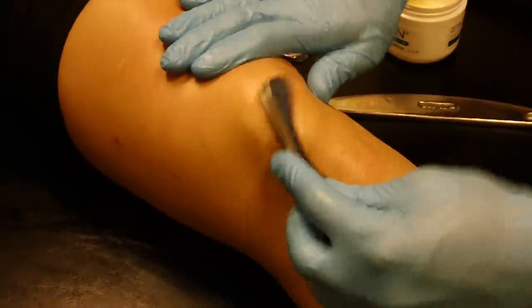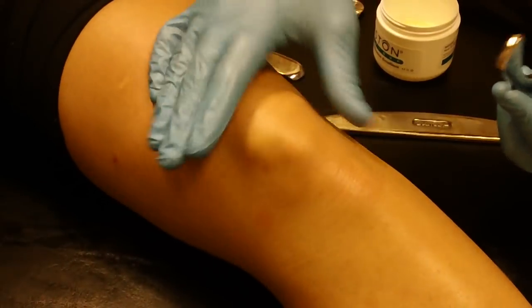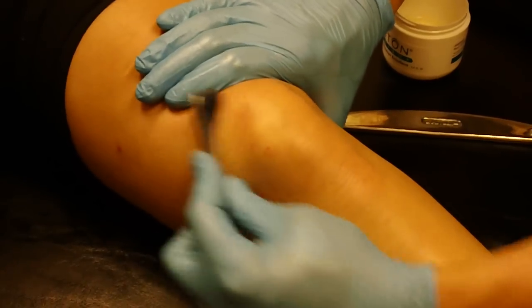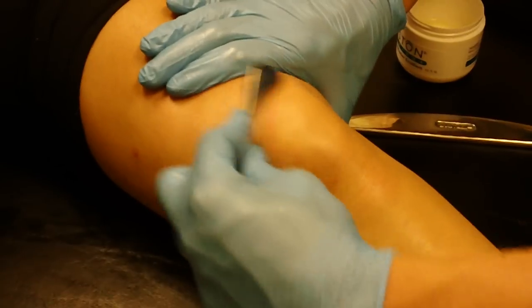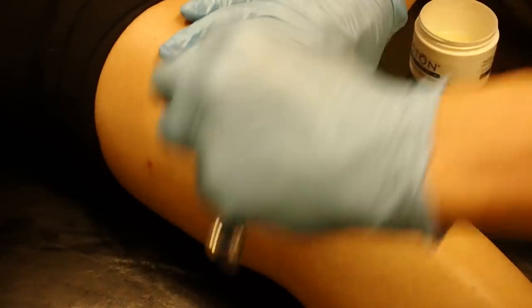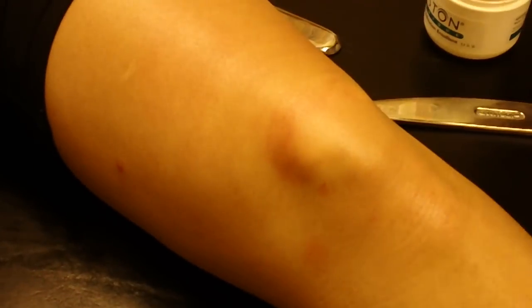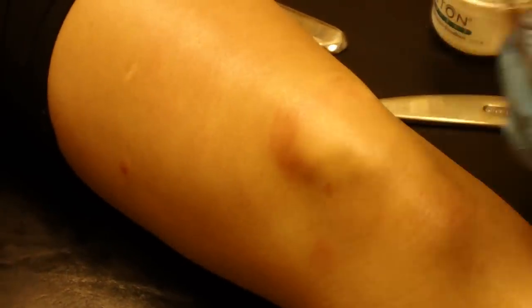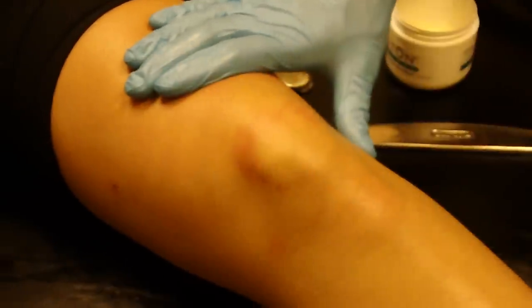If I was wanting to frame around the kneecap itself — for instance, if I was working with patellar tracking disorder or chondromalacia patella — we are able to frame right around that kneecap and work out some of the adhesions and restrictions right as that patella rides in the tendon. You can see just with a few quick strokes how much response we're getting. This instrument has more of a rounded edge and more of an aggressive edge, and the aggressive edge is going to catch more restrictions.